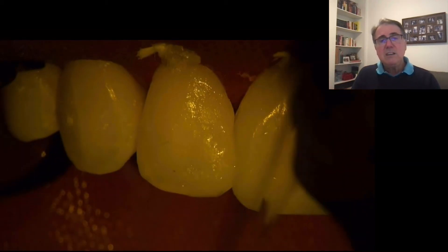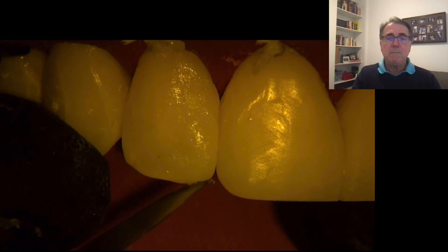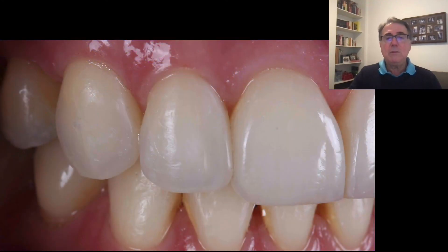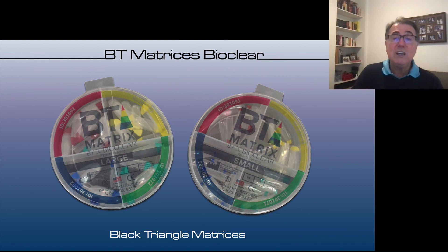Very easy, very simple, and gives you a nice result. I always get my mylar stripe and pass it through from buccal to lingual to create the proper contour on the proximal surfaces. That's the restoration — chromatic enamel Renamel A1, and achromatic enamel Renamel light incisal. I hope you enjoyed it. Next time we're going to be discussing how we can use the BioClear matrices to do diastema closure. Thank you very much for watching.